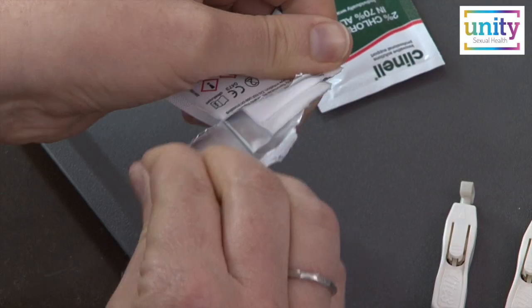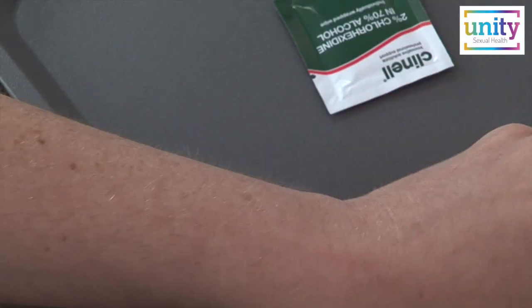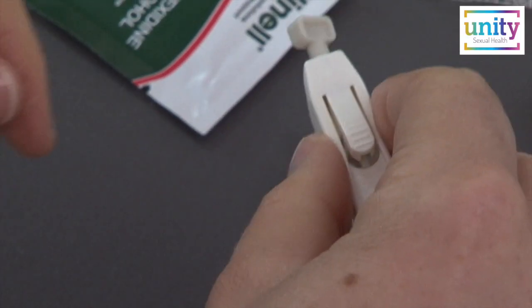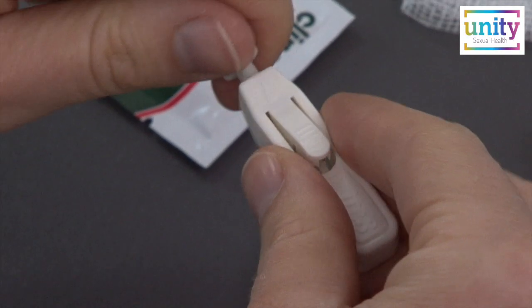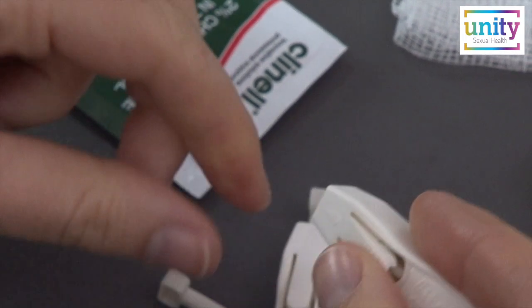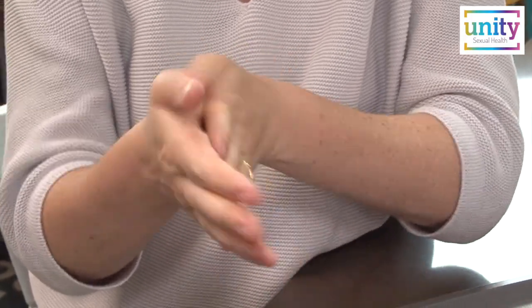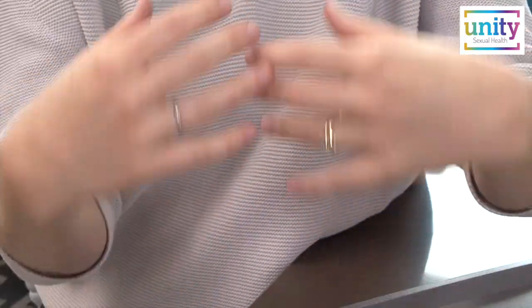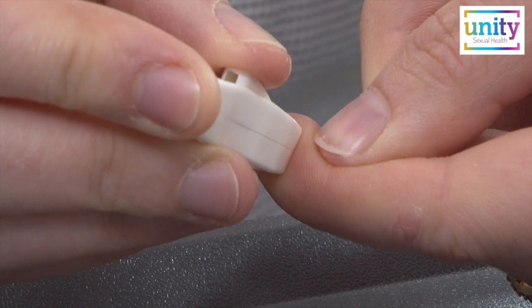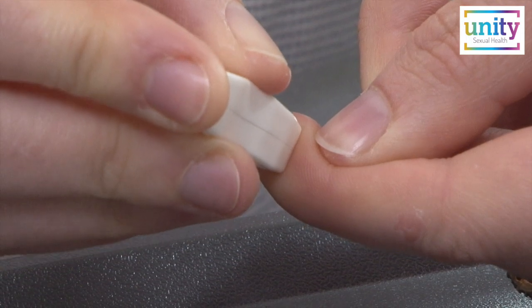Once your hand is warm enough, choose one of your fingers and clean it with the alcohol wipe. Pick up the lancet, gently hold each end and twist, then pull apart — this will remove the seal. Each lancet can only be used once. Now rub your hands together briskly to stimulate the blood flow. You may wish to shake them. Now place the small end of the lancet against your chosen finger and press firmly. This will break the skin.